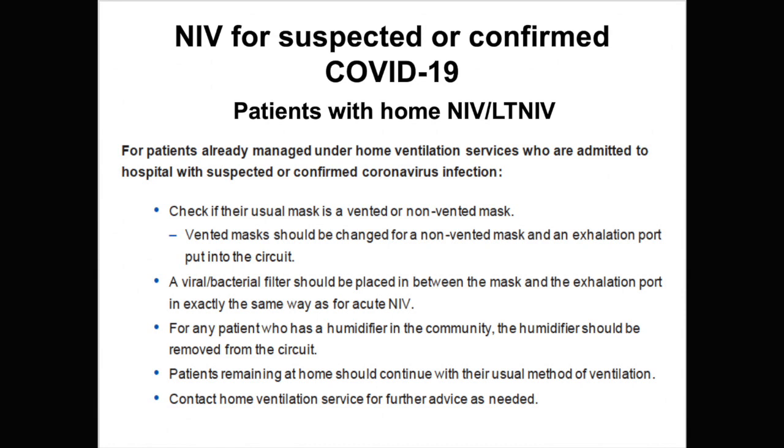I would strongly recommend, though, that when you're looking after patients with suspected or confirmed COVID-19, that you do consult your local infection control policy and guideline. Our practice at present for individuals who are suspected or confirmed COVID-19 is that independent of the NIV circuit or mask that you're using, we are still using full personal protective equipment as recommended by our local infection control policy.